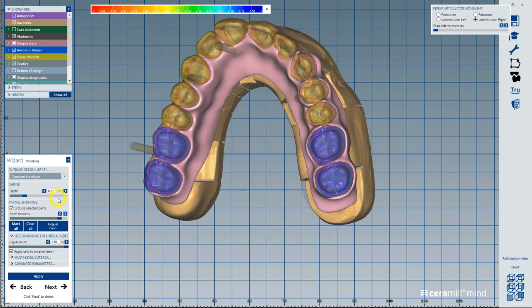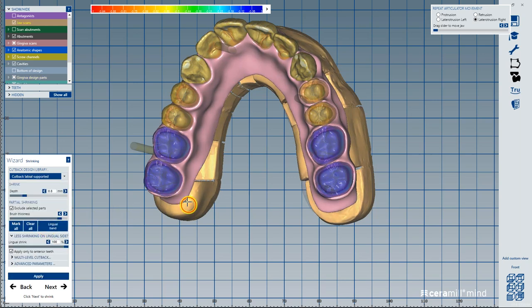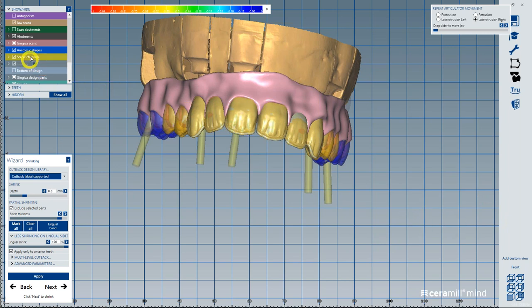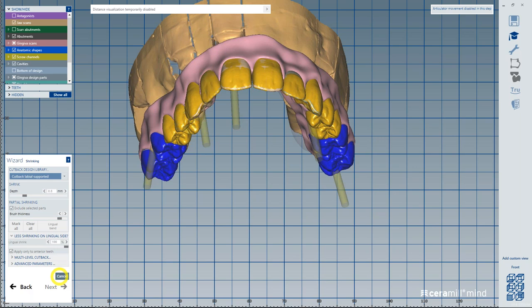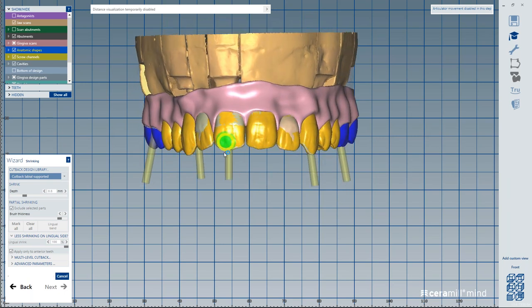So on my cutback now, I can drop down and select what type of cutback. Let's pick labial supported. So now if you look at this, oh, I see one more spot I need to paint. There we go. So if you look at this, you can see what the cutback is going to look like before you reduce. So let's apply. And I've had to do this manually many times. I can tell you it's really nice once we got this cutback library to have that generated automatically for us.